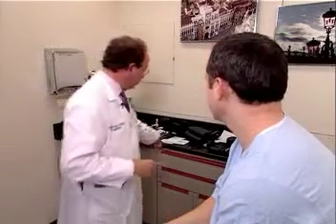Mr. Johnson, we're going to start with assessment of your vision. Visual acuity is determined by either a wall-mounted Snellen chart or, very commonly, a pocket Snellen chart, as I have here. Mr. Johnson, would you take your right palm and place it over your right eye? I'm going to hold this about 14 inches in front of Mr. Johnson's left eye. Could you read the smallest line possible?